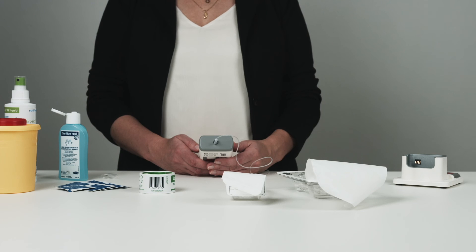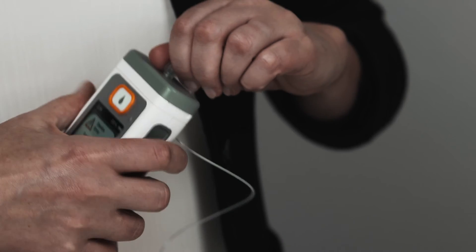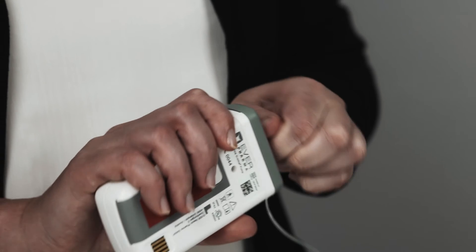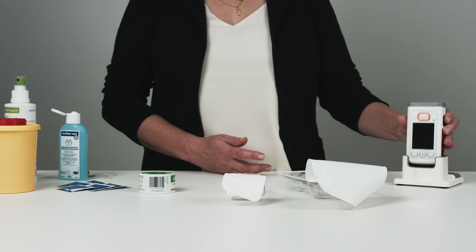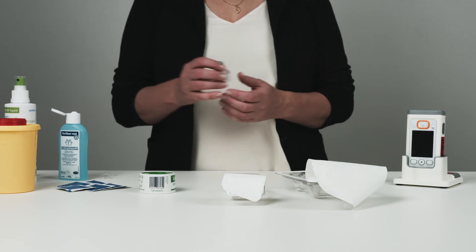To stop the pump, press the stop button. Remove and discard the infusion line. Place the pump in the docking station so it can charge, and put a stopper on the reservoir.